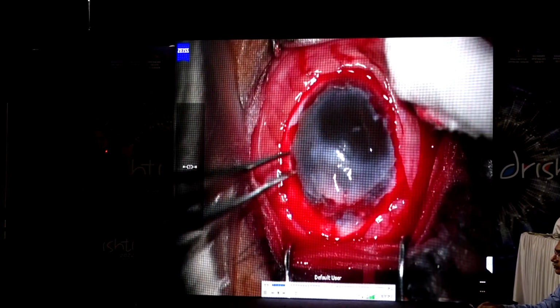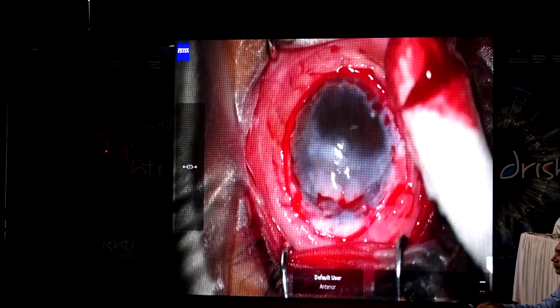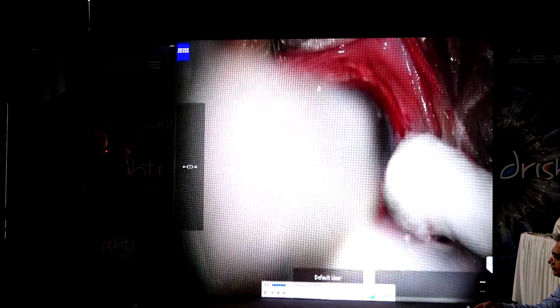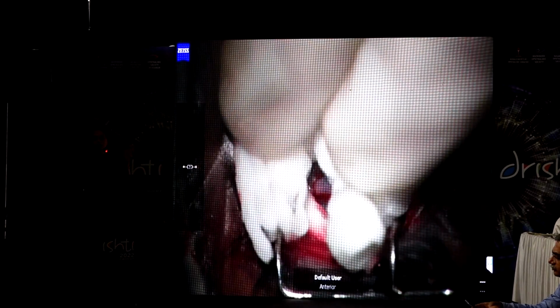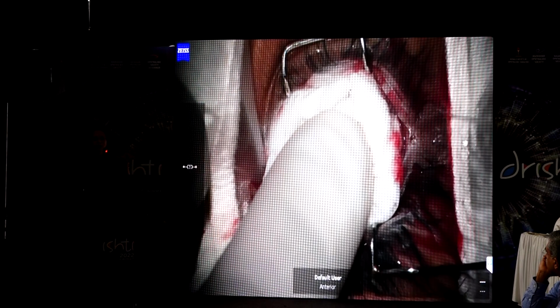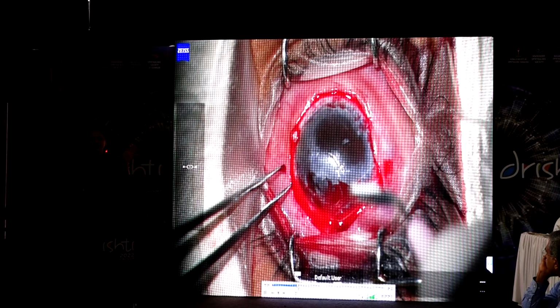So once I've done a 360 degrees peritomy and superiorly I've released all the symblepharon with the lids and subconjunctivally as well, I follow this technique of making two horizontal snips at the 3 o'clock and the 9 o'clock position. Again, here I use minimal cautery, and I pack the surface 2 or 3 times with adrenaline soaked swabs, and that really helps. You might spend about 5 to 10 minutes on this, but that really helps to control the bleeding, giving you adequate hemostasis without having to use cautery on these surfaces which are already scarred here.